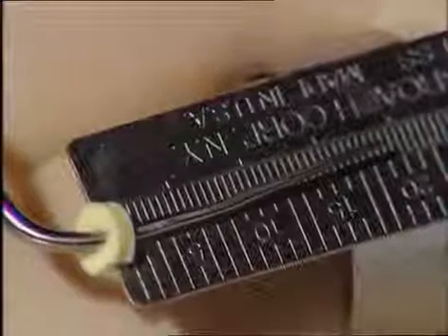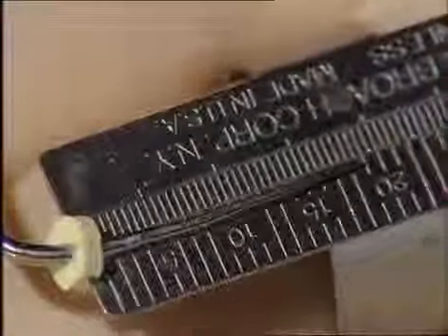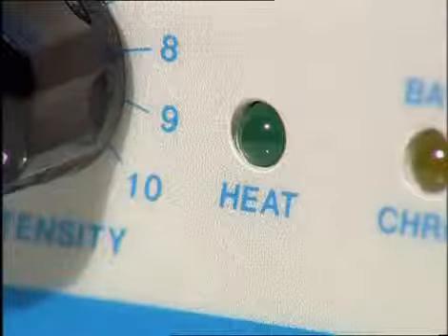A rubber stop is placed on the heat carrier of the touch and heat instrument so that it will be worked to within 5 to 7 millimeters from the canal terminus. The useless portion of the cone is removed at the orifice level.